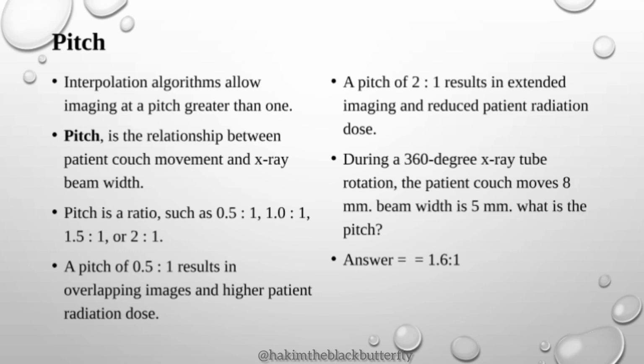In order to get that data which is missing, interpolation must be done. After interpolation has been done, then the slices have enough information to display. And this reduces blurring if those images are reconstructed in other views, like the sagittal and the coronal.